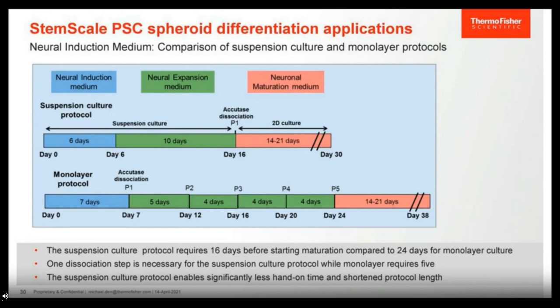So right, the duration and hands-on time is decreased significantly for the suspension culture protocols.